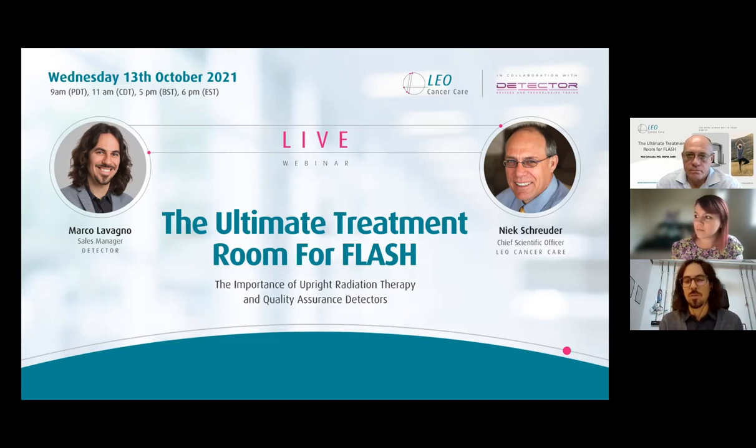If we see damage on an electronic board, we never know if it was caused by a neutron or not. At the moment, with the experiments we carried out with flash therapy rates at the Particle Therapy Center, we didn't experience that, especially because if we're talking about QA systems, it's just a daily measurement, not a constant rate. So of course we already think about shieldings for the parts that are more sensitive.